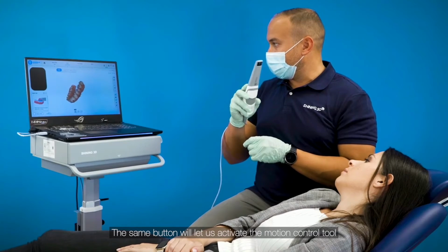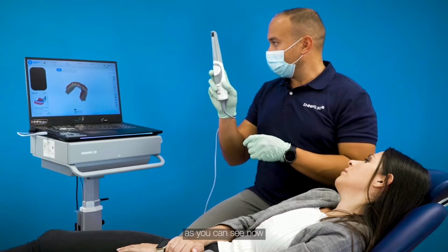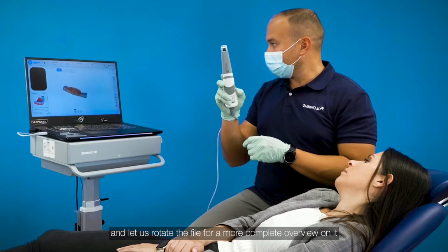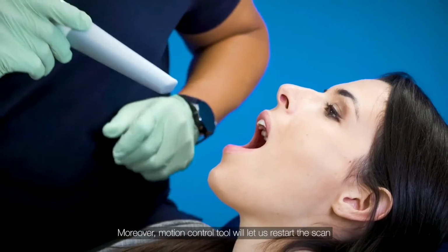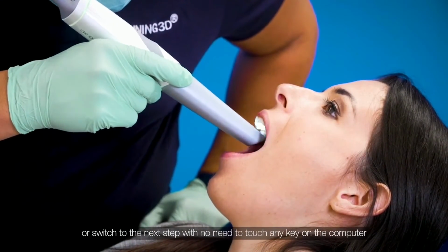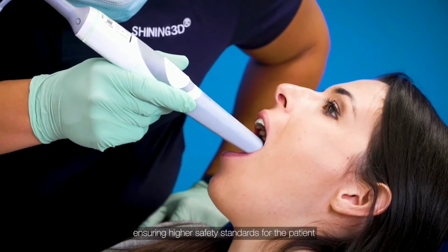The same button will let us activate the motion control tool, as you can see now, and let us rotate the file for a more complete overview of it. Moreover, the motion control tool will let us restart the scan or switch to the next step, with no need to touch any key on the computer, ensuring higher safety standards for the patient.